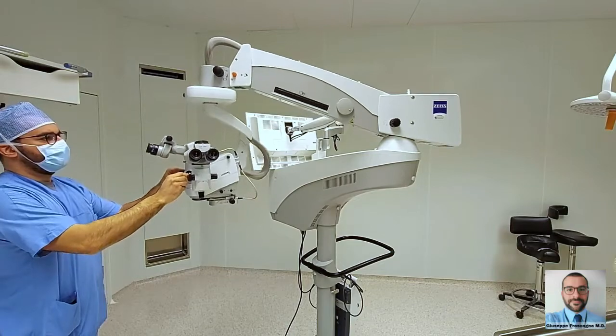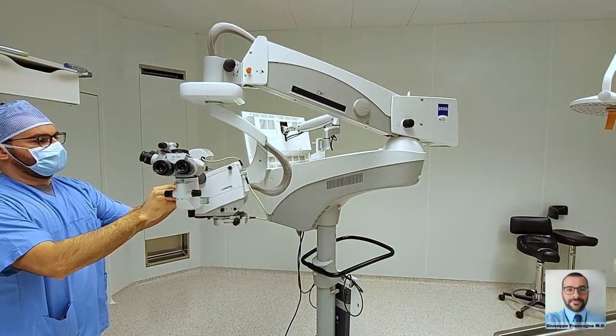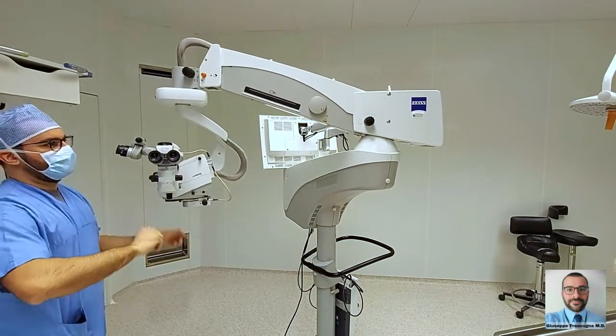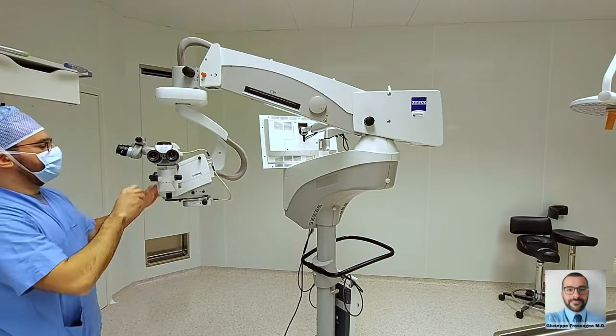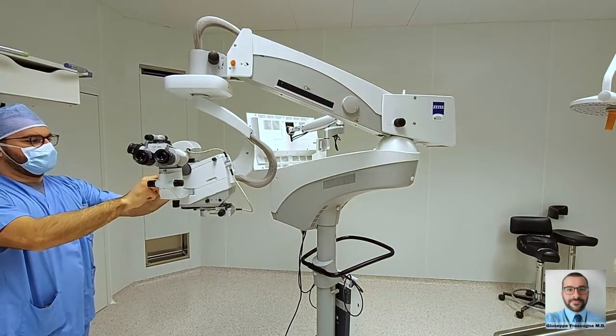Rotation of the sterile handles releases the electromagnetic brakes of the main arm, making it possible to move the microscope along the three axes of space. If the microscope does not perfectly remain in the desired position, you have to calibrate the balance using the knob at the base of the main arm.